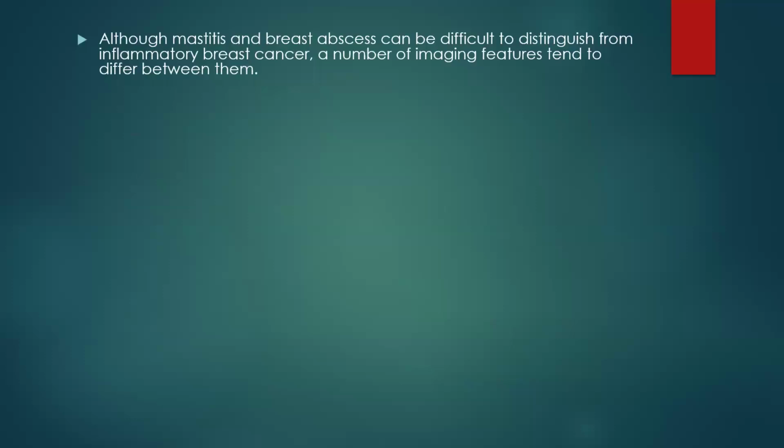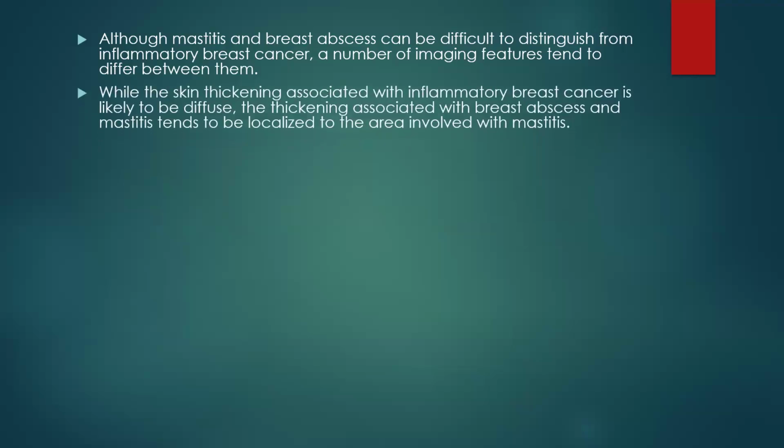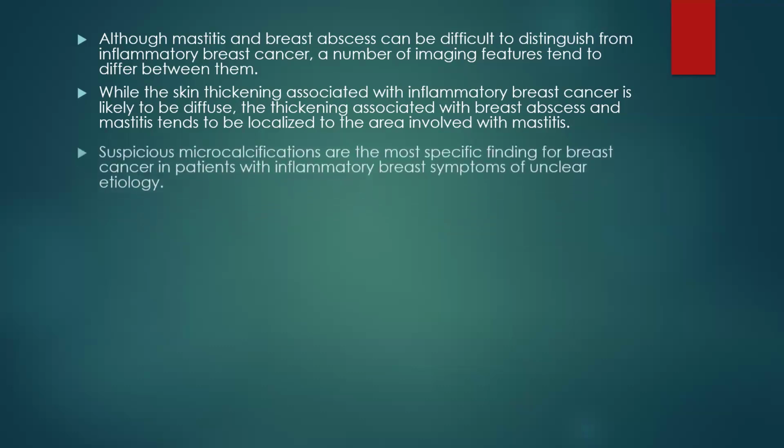Although mastitis and breast abscesses can be difficult to distinguish from inflammatory breast cancer, a number of imaging features tend to differ between them. So you could use these to distinguish between the two. While the skin thickening associated with inflammatory breast cancer is likely to be diffuse, the thickening associated with breast abscess and mastitis tends to be localized or focal to the area involved with mastitis.